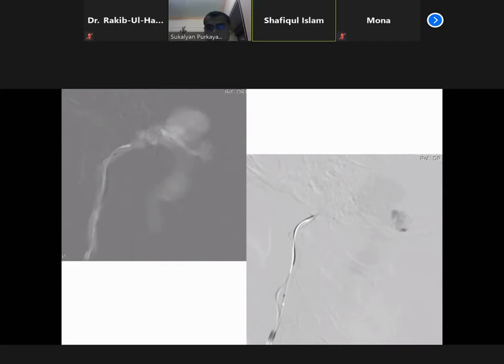So in the pial AVM malformation also, when you are inside the nidus, how do you know you are inside the nidus? Because inside the nidus, there are many microfistulae. So when you inject, the vein will fill directly. So that is the area where you start your embolization.